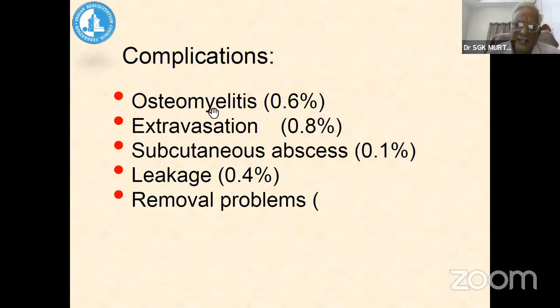And sometimes we may be introducing some infections and extravasation of the drugs and fluids, whatever we give. And sometimes if there is hematoma, there can be a subcutaneous abscess. And sometimes on removal, the needle can break in the bone, and removal may be difficult sometimes.